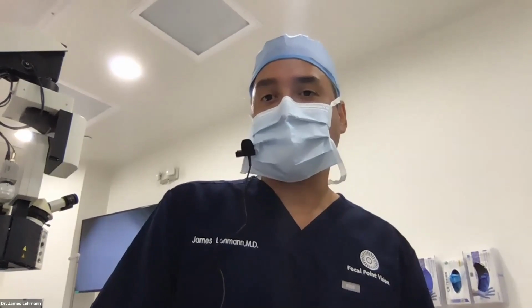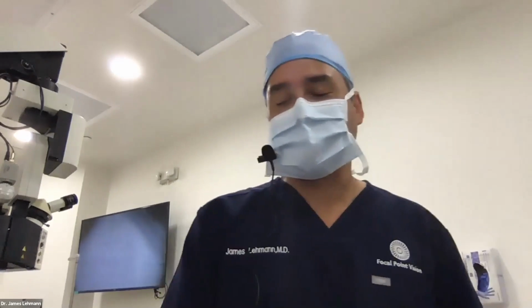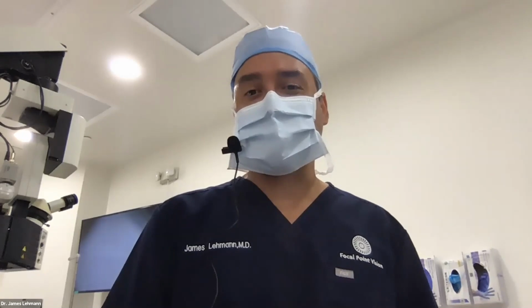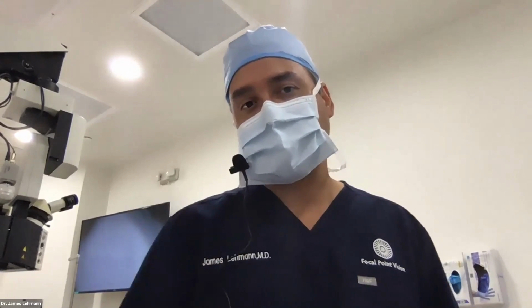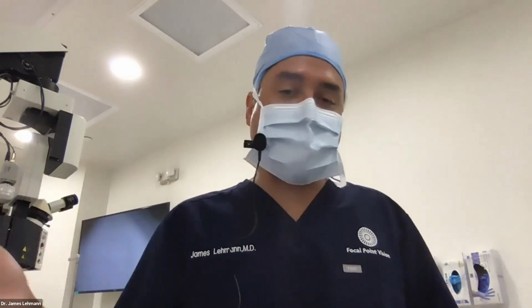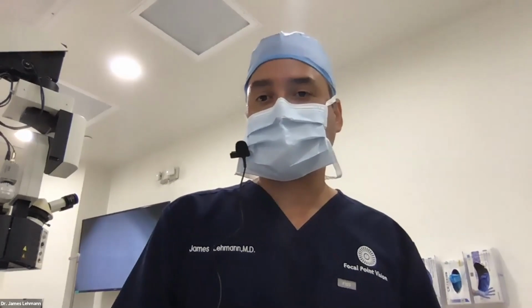Dr. Turtog asks, in case of posterior polar cataract, what's the technique? You have to say 3 Hail Marys. No, I'm just kidding. What you do is you need to do hydrodelineation in those, and don't try to rotate the nucleus or do hydrodissection. They're generally soft, thankfully, and so you remove as much as you can, leaving that little plaque there at the back for last. The majority of the time you're going to be safe, and then sometimes when you take it off, the capsule will tear. So then you got to put a lens in the sulcus and do optic capture.